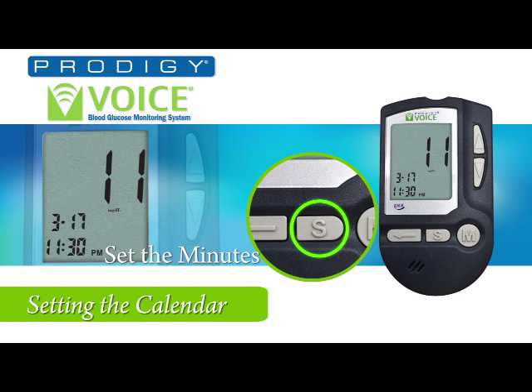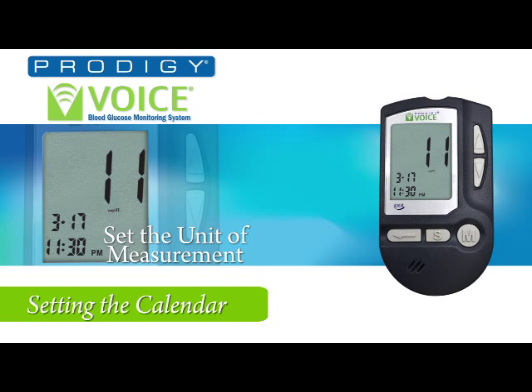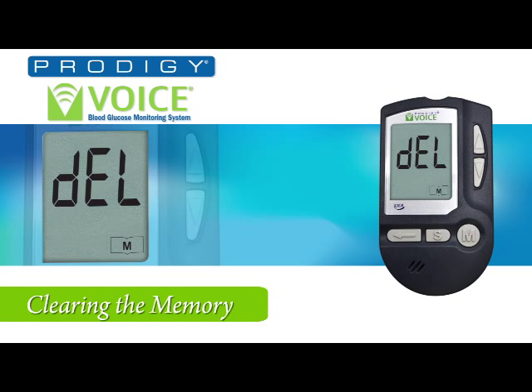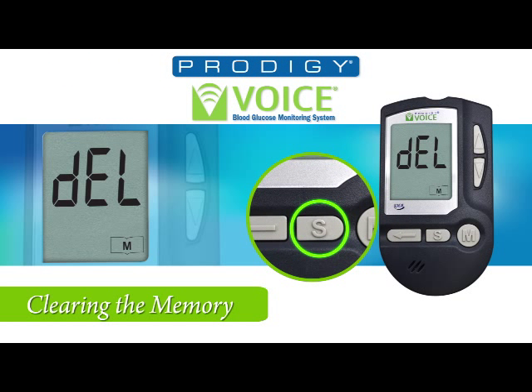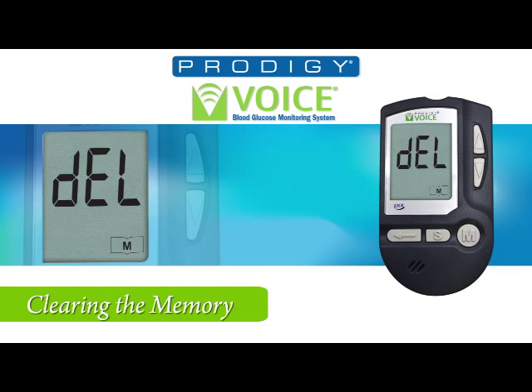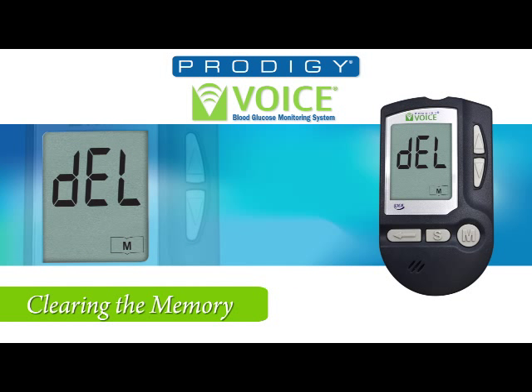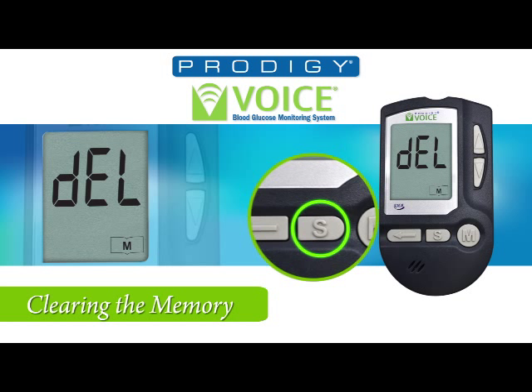Press the set button to set the unit of measurement. You will hear: 'Blood glucose unit is milligrams per deciliter.' Now press the up or down buttons for desired unit of measurement — millimoles per liter. You will now hear: 'Deleting record function.' To skip, press the set button. Or if you wish to delete the record, press the M key for 5 seconds and all records will be deleted. To avoid deleting the memory, press the set button.